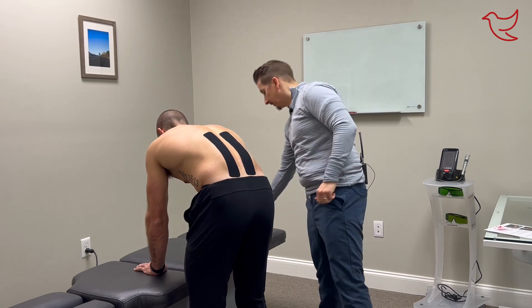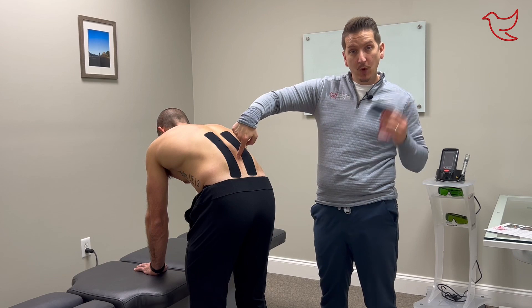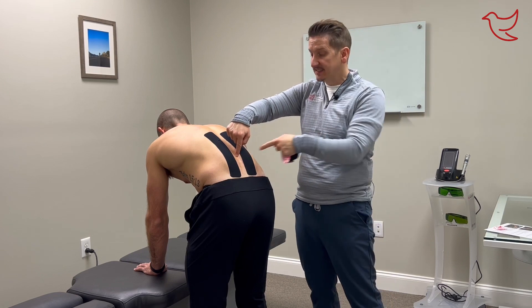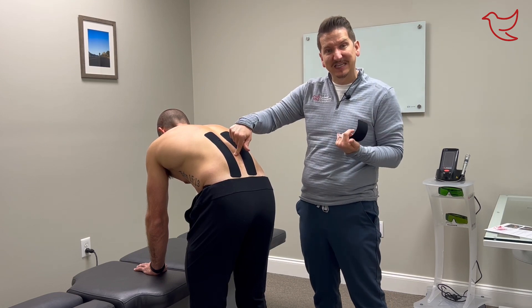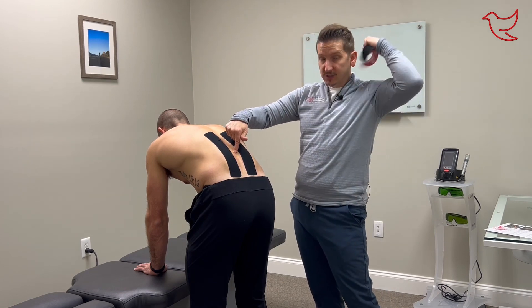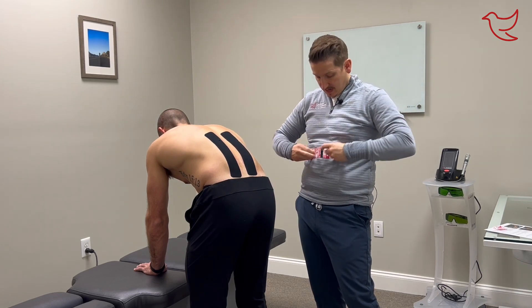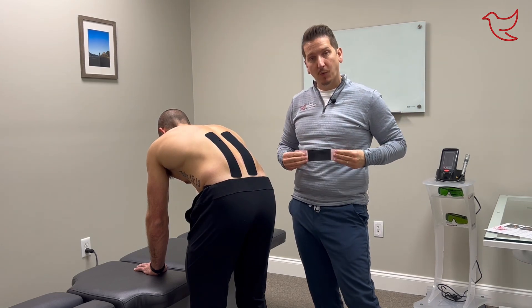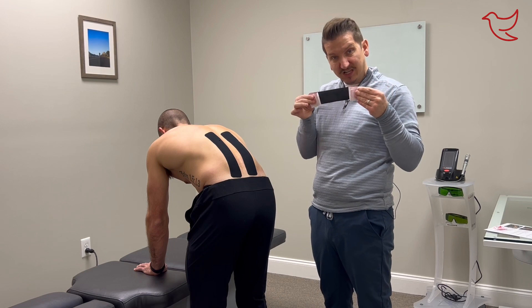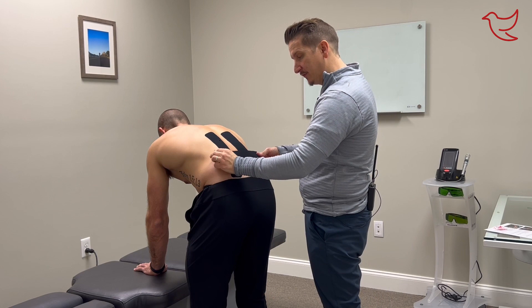Let's imagine Daniel has told me it hurts right here — we put our last piece of tape right on top of the painful area. It creates a touch sensation, and that touch sensation actually kills pain. It's the same reason why when you stub your toe you rub it, or you hit your head on a car door and start rubbing that area — touch sensation kills pain. For this piece we apply about 50% tension — there's a lot of stretch in this tape — and put it right on top of that painful area, then no tension towards the sides where it's our anchor.